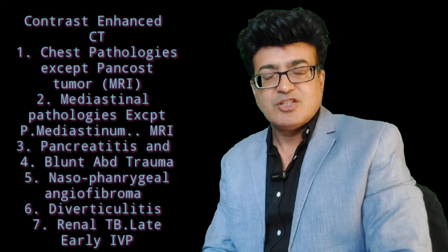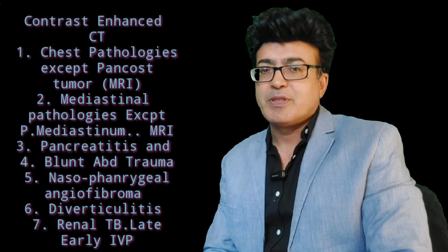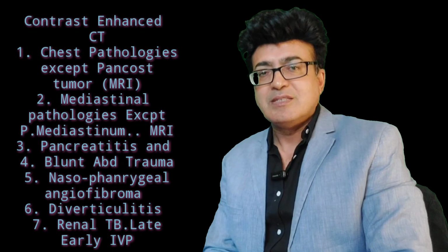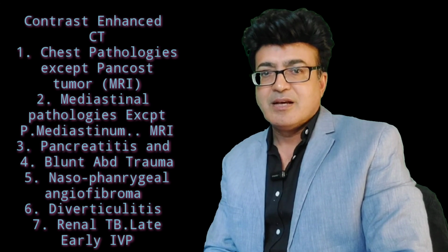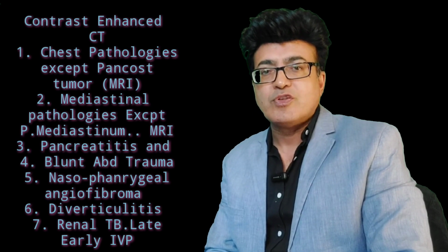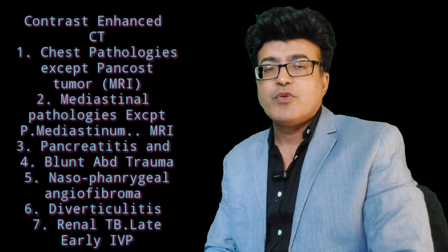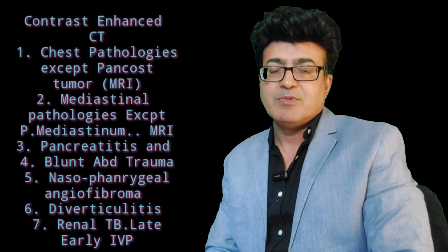Contrast enhanced CT is when you inject a contrast agent to localize the pathology during the CT scan process. Contrast enhanced CT is used for the detection of chest pathologies, but not for the Pancoast tumor. Pancoast tumor can be detected on the MRI images.